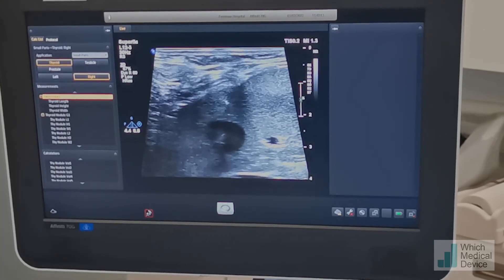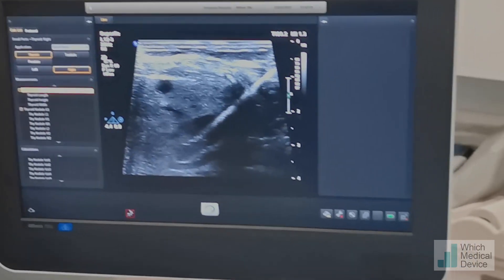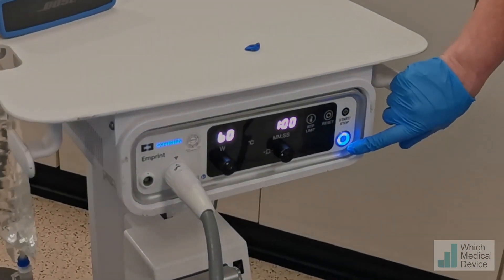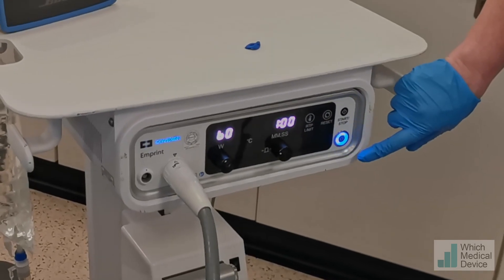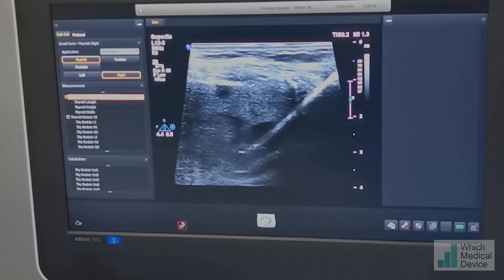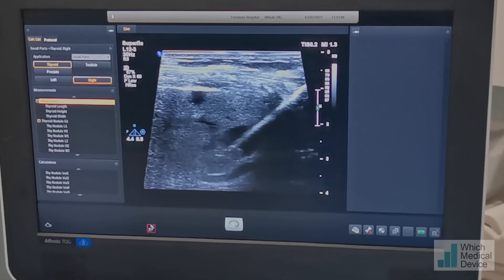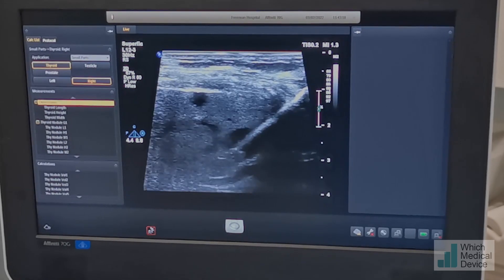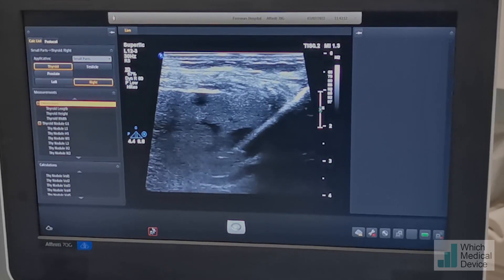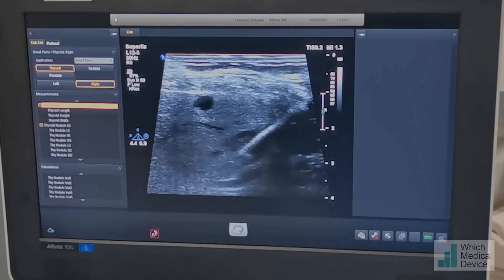You actually look like you're right in the middle. Ready to ablate now. We're just going to go for 60 seconds at 60 watts, and I think that should be sufficient for this small lesion. We'll press start. Let us know if you feel any discomfort — I don't think you will. We'll just keep watching this and we should see some gas formation very shortly.